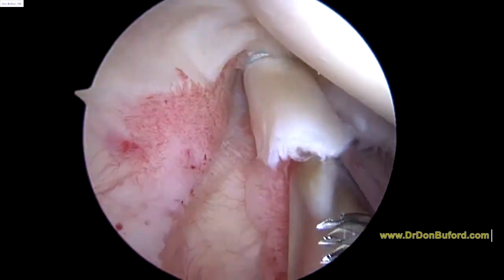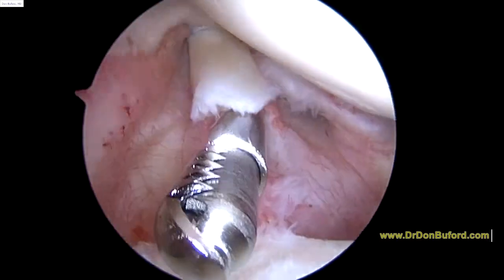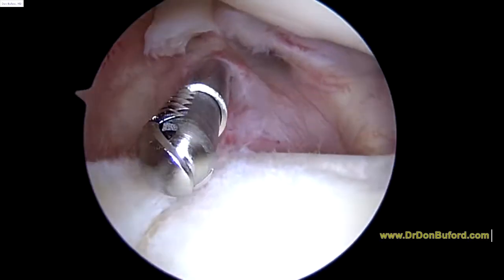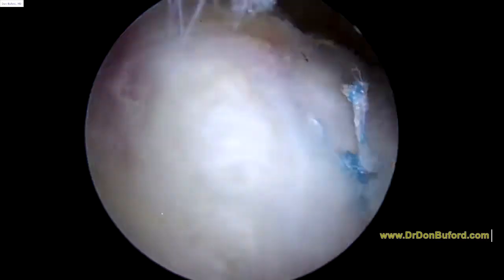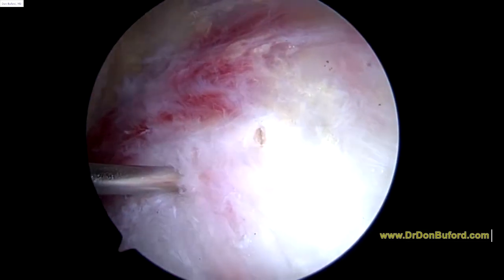We've released the biceps — you can see it there. Now we know that this will progress, and hopefully you should not have any pain from there. We're going to go ahead and go up into the subacromial space and have a look at the rotator cuff, and tie down the biceps tendon. We've tied the suture for the biceps tendon — there it is right there. That's securing the biceps, and now we're just making sure that we've made some little vent holes to release calcium.